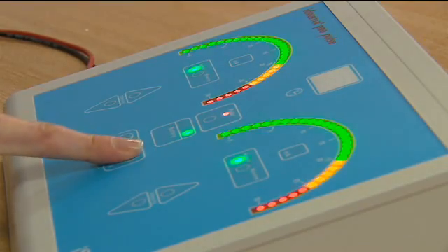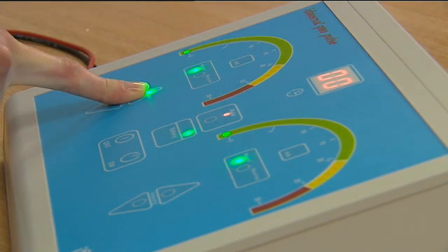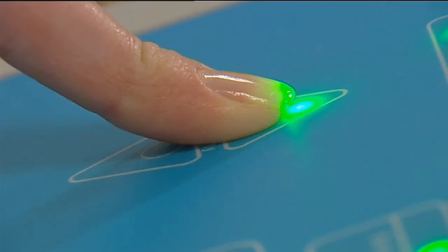Turn the machine on. Increase the current slowly by depressing the upward arrow on the machine to the maximum level tolerable, but not above 20mA.